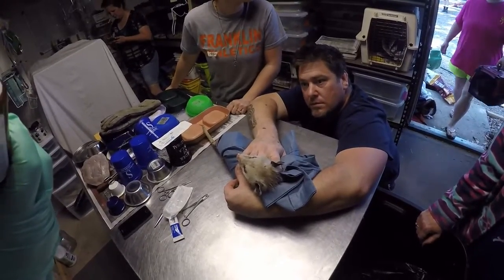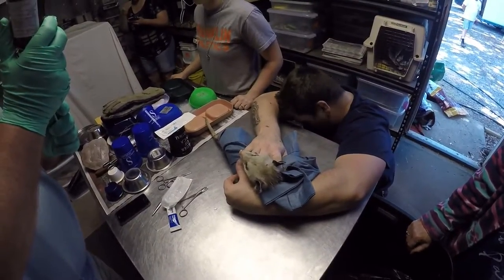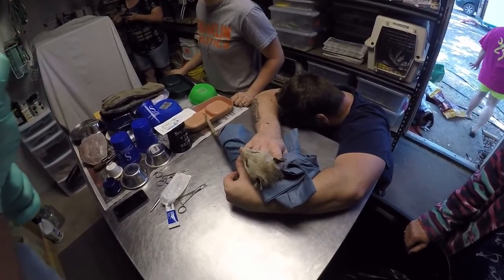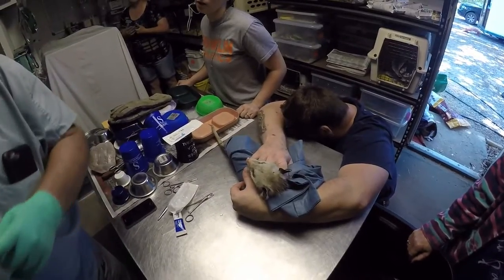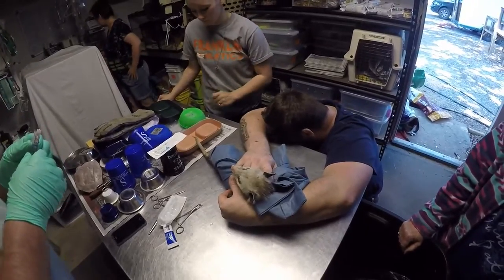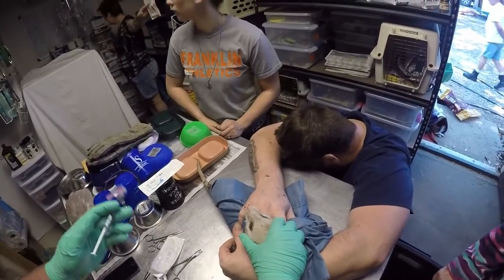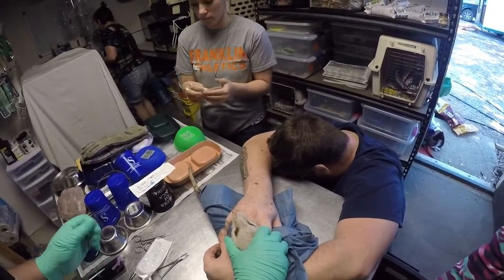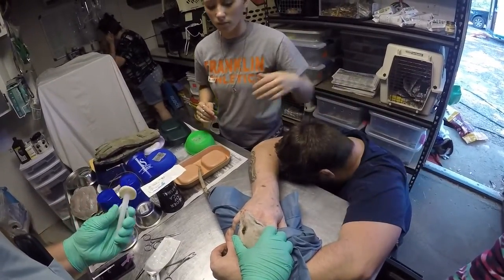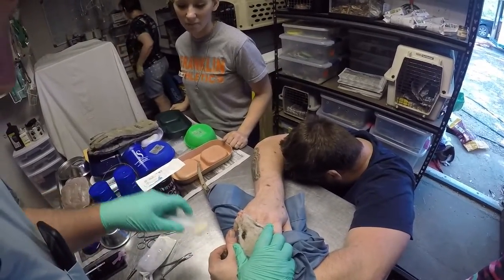Be aware we're doing eyeball. You might need to pull back, then stick in, put pressure, put air in there. That's a little bitty. That's what he wanted. I have to scrub you guys. Do you want to pour a friend to scrub? Yes, actually. We still have — you got the sutures that you need, Abby? Yep. You are awesome. I know I am. Love it.